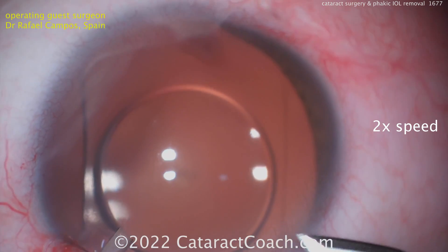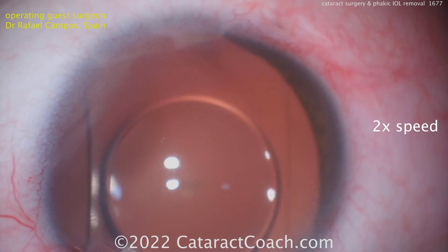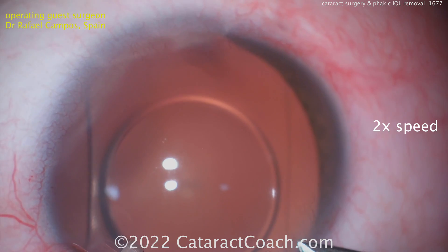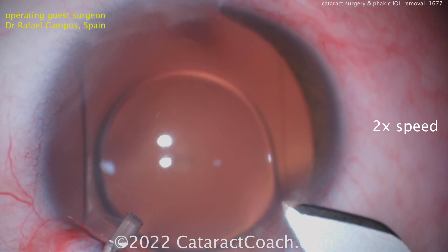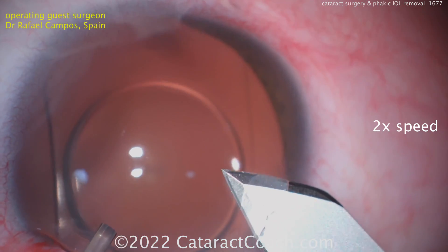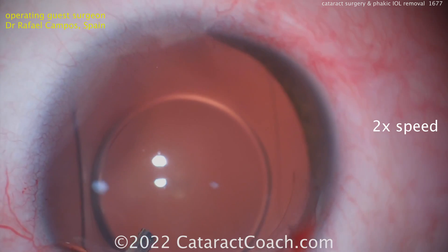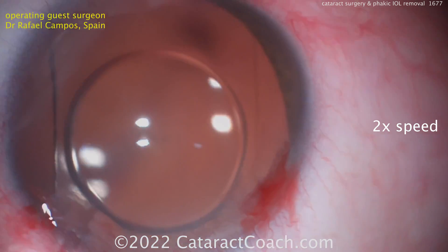Starting off here, putting some anesthetic in the eye, fixating the eye. Here comes the main incision. You're probably not going to be able to open that old incision because this surgery was likely done at least 10 years ago, maybe even 20 years ago.